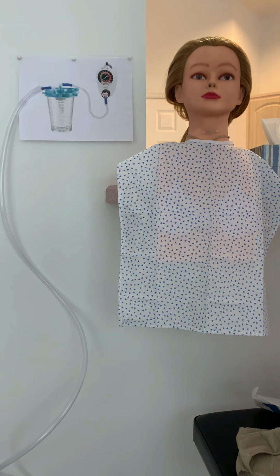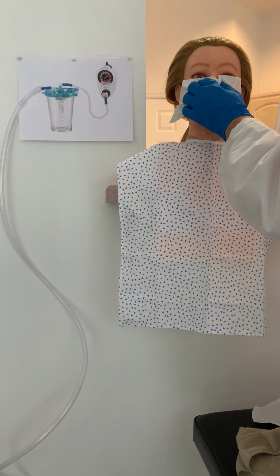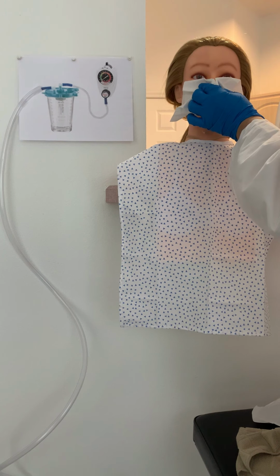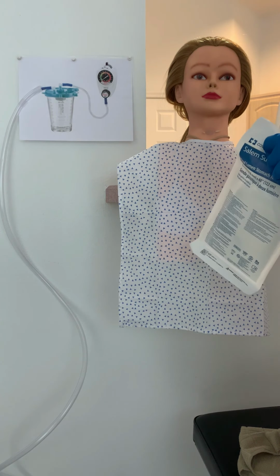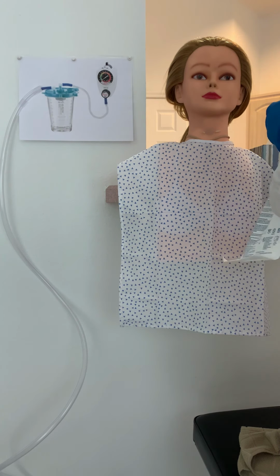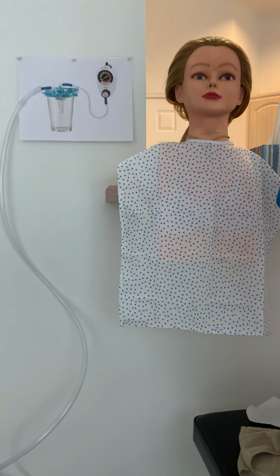Next thing I'm going to do is have her blow her nose. So go ahead and blow everything out of your nostrils for me. Okay, good, thank you. Next, we will open up our Salem sump tube. And we're going to take this out.